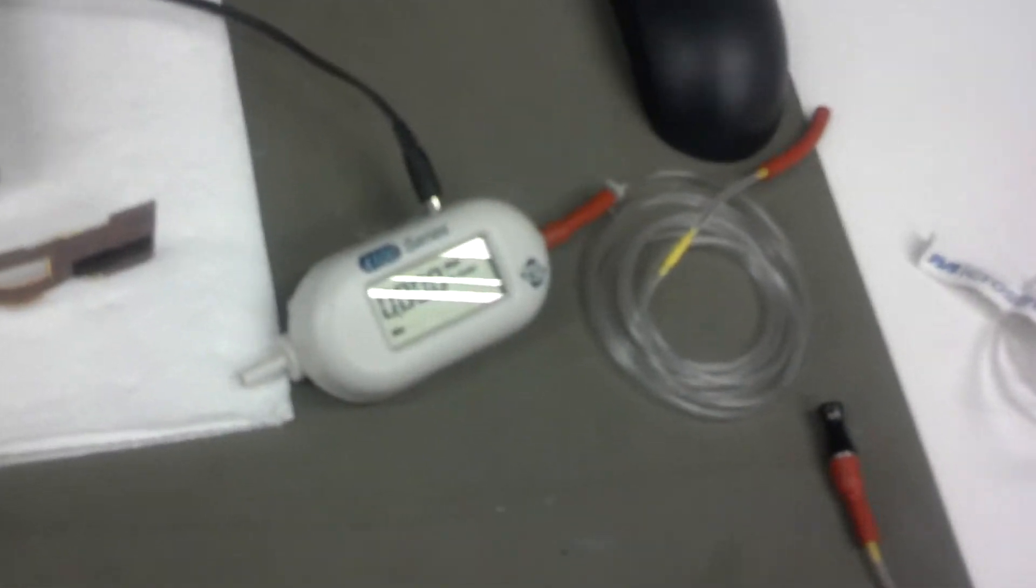Okay, here's your module. I'm going to perform the leakage test. Now first I'm going to hook up the flow meter to the output.